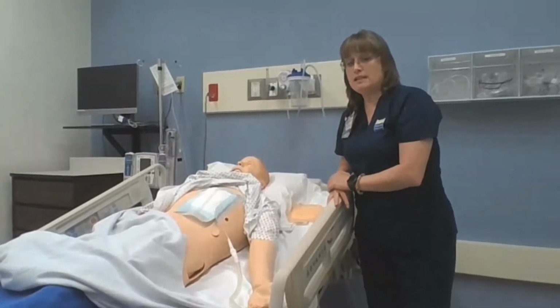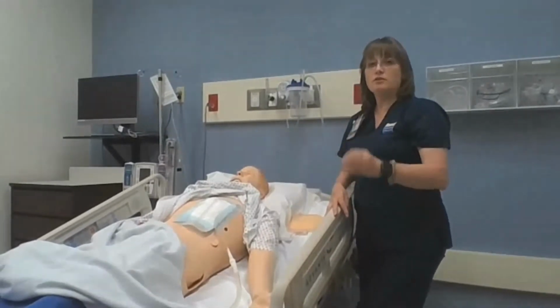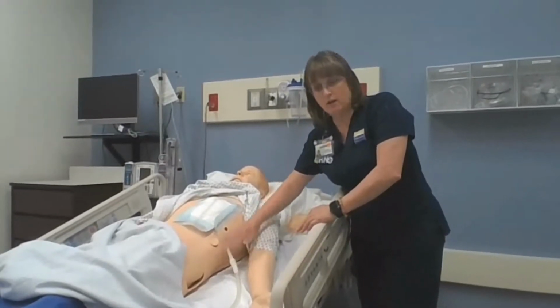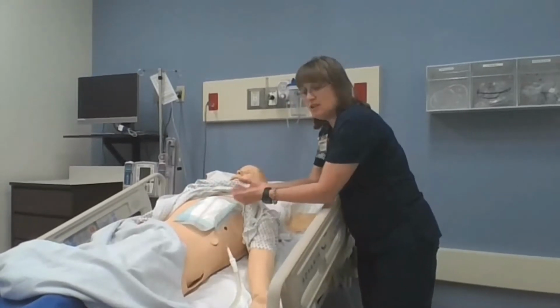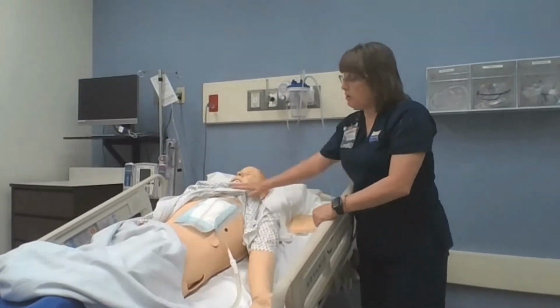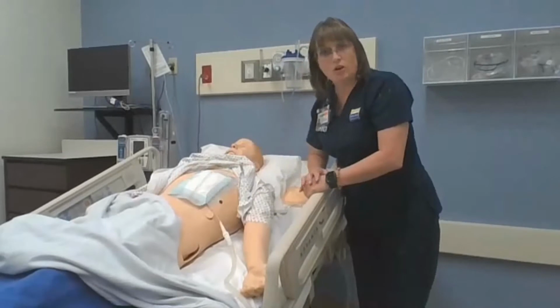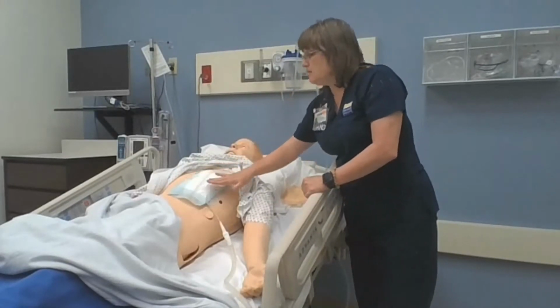Now I know what you learned for ATI is that it's supposed to be taped on three sides if there was an emergency and that chest tube fell out. So if the chest tube has been displaced, that tube fell out, and I had those thick pieces of white tape going across, I would lift up one side so that I wouldn't get a tension pneumo. Okay, so if everything's all good, this chest tube is in place, I'm looking to see, is my dressing taped on all four sides?